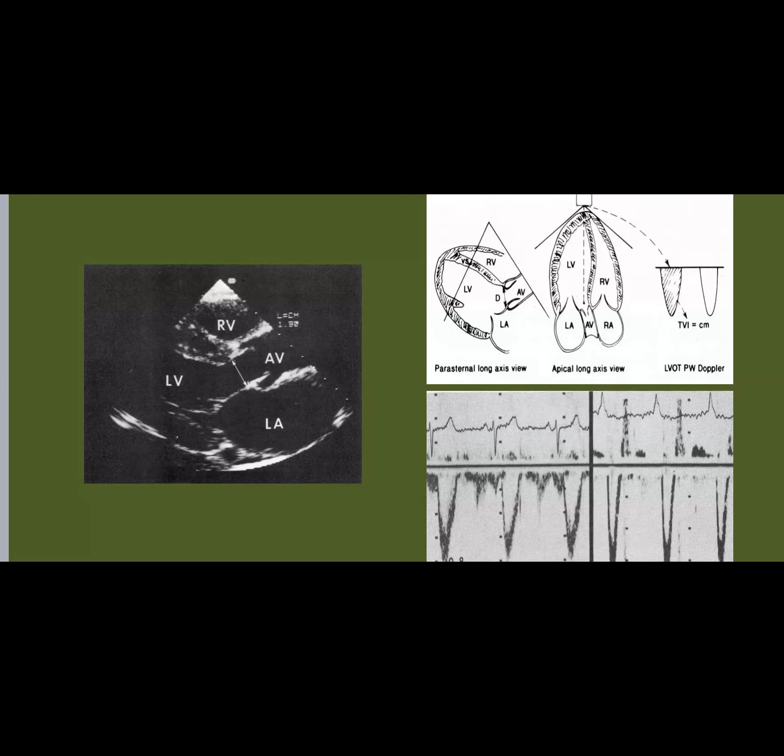So in other words, the ejection fraction is the stroke volume over the LV end diastolic volume. The ejection fraction is the percentage of the stroke volume from the end diastolic volume. So they are highly correlated. Good. But there is a different way of assessing stroke volume that does not use Simpson.